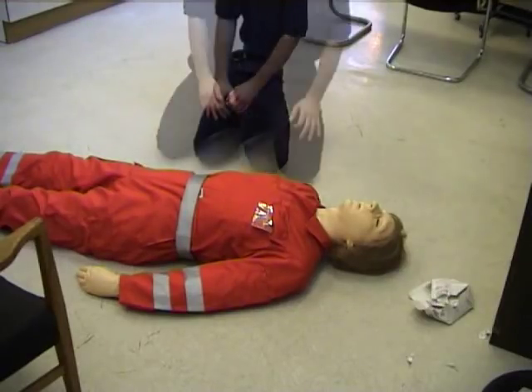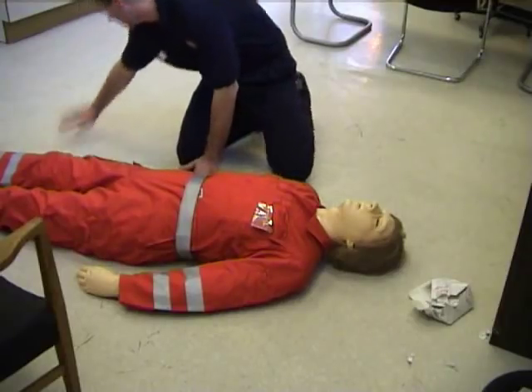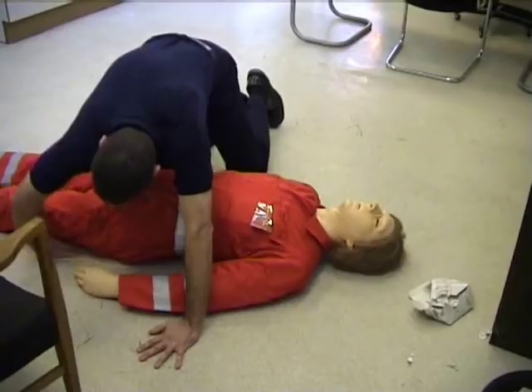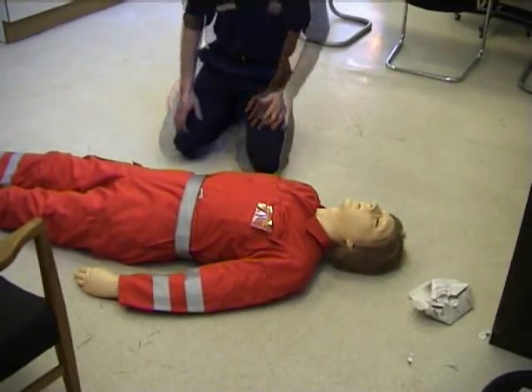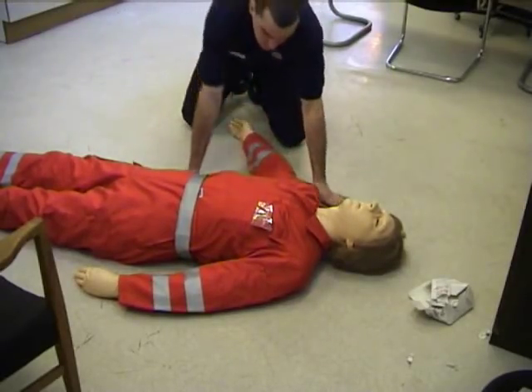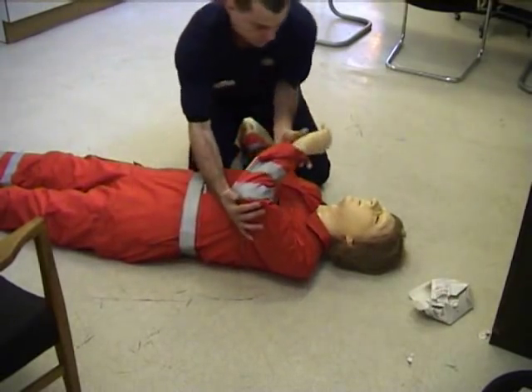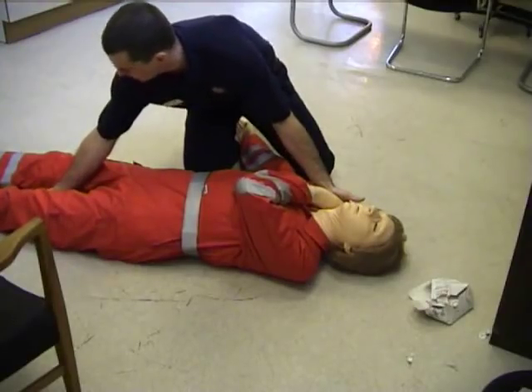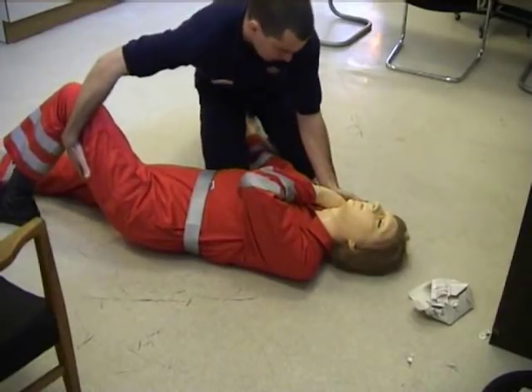Any signs of identification or any sharp implements. Sharp implements — what is the bleeding for anyway? Ok, can't see any signs. Right. So now you're going to turn him into the recovery position — where's the other one going? Just find the natural position in that one. Which side of the knee do you want? Ok, I'm just going to roll you over now.